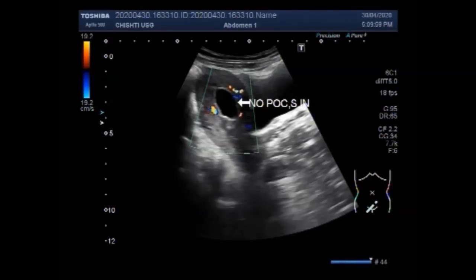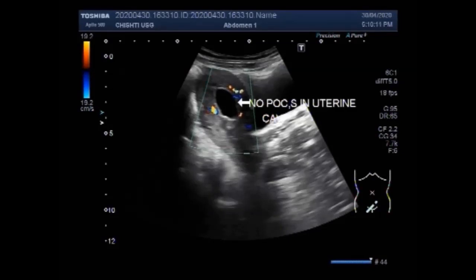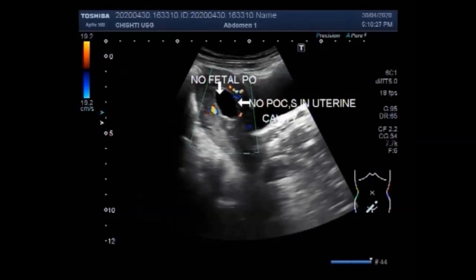You can see the gestational sac. There is no product of conception seen in the gestational sac — the gestational sac is empty. An empty sac pregnancy is when the pregnancy stopped growing before the fetus developed. Using the watch and wait option, this type of miscarriage will pass on its own only 66% of the time and may take many weeks.